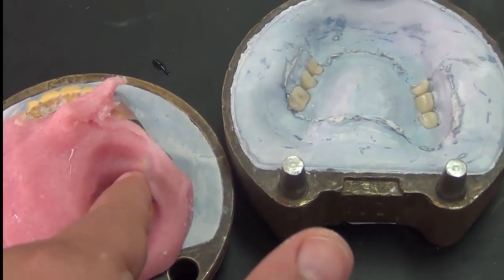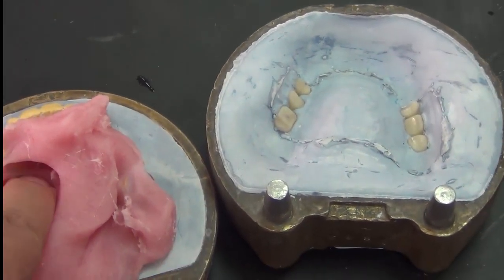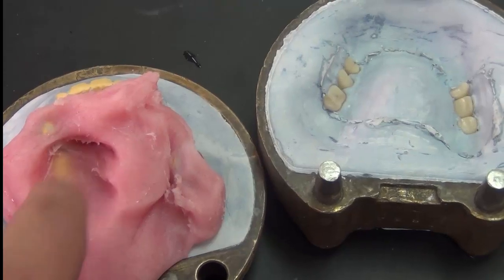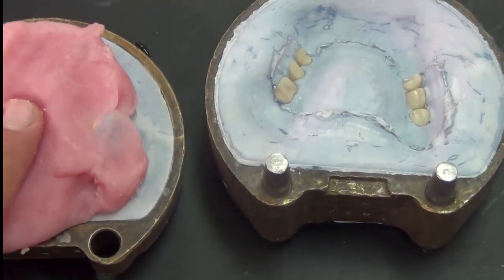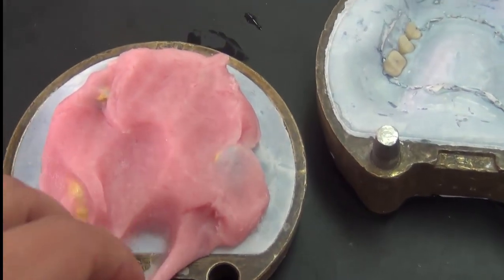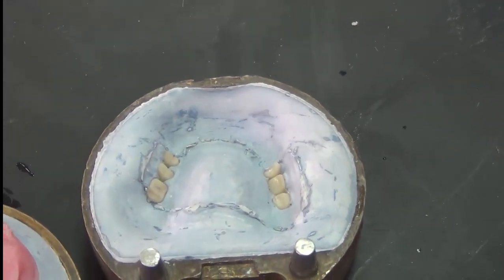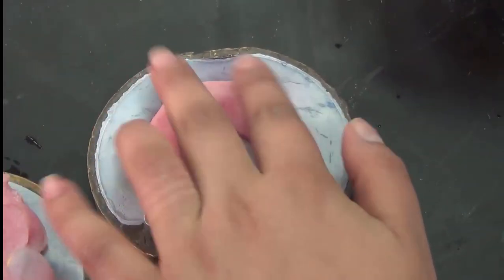So I'm pressing under the wire first, and then I'm adding more material for the thickness. So I'm going around the wires and emphasizing the placement of acrylic beneath the wire. So I'm seeing the acrylic going beneath the wire. Okay, so emphasizing the wires and then adding the bulk of material over it. I also have part of the material, we just added excess material just to show you the procedure. But on the other side, we also place the dough and we begin packing it around the teeth themselves. So you also see that using our fingers, we're going to press the acrylic in between the teeth.